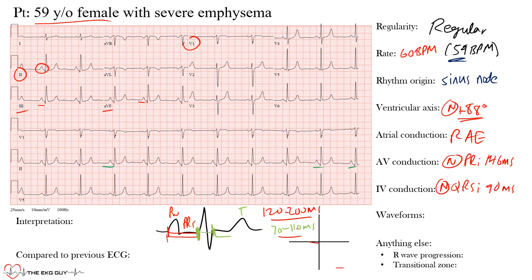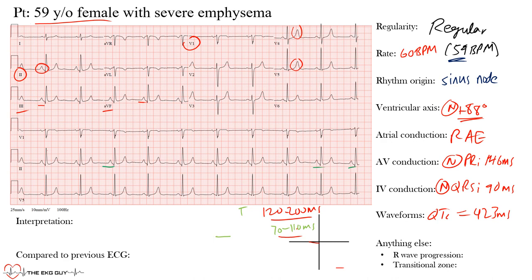Looking at waveforms: is there PR elevation or depression? No. ST segment elevation or depression? Not significantly here. Abnormal T-waves? They're slightly pointed but asymmetric, which is normal. This patient has no evidence of hyperkalemia, which can cause peaked T-waves especially in the anterior precordial leads. The corrected QT interval (QTc) was 423 ms, which is normal — in females, less than 460 ms is normal; in males, less than 440 ms.